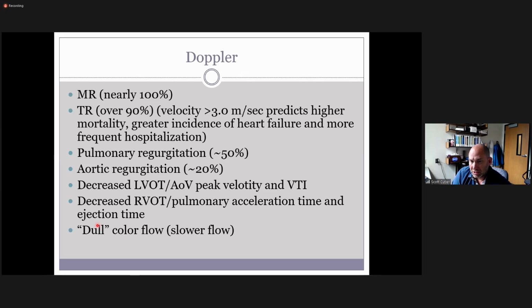So they may do limited exams, and the important thing in a limited exam is that you get what you need and get out. You don't do the entire protocol, you don't do all these extra steps that take a lot of time and measurements. So the whole point of doing these pathology things is for us to evaluate your critical thinking and to see, of that protocol, what of these images are relevant to what I'm doing.